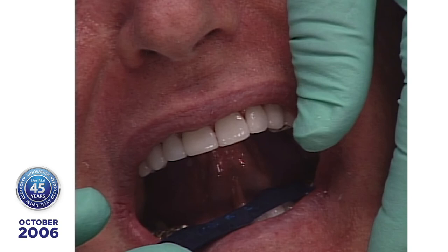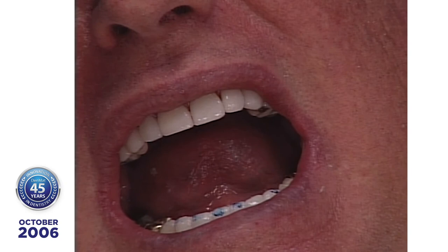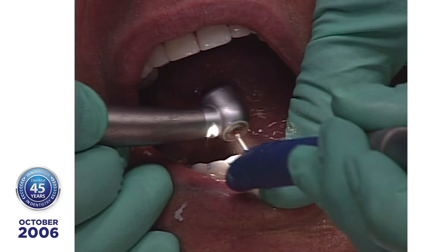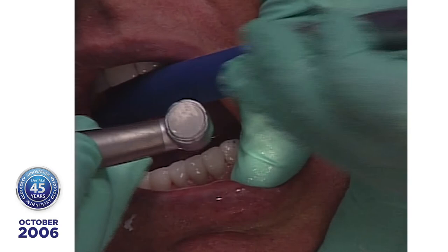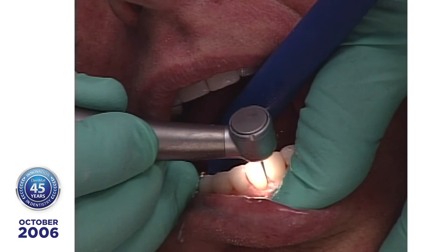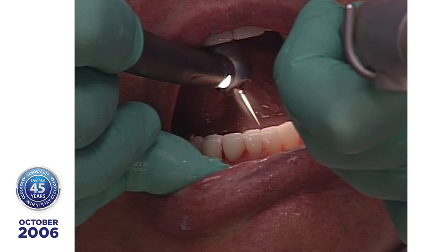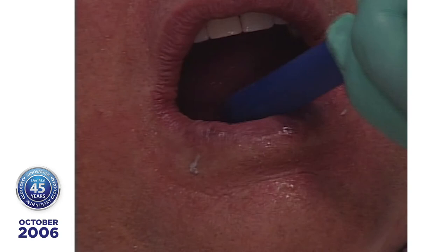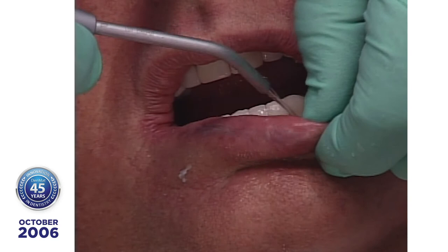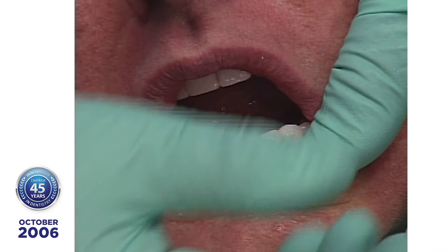See all those spots in there? What we want to do is take a long, ultra-fine diamond and gently contour these teeth so they don't hit so much. And I'm going to leave the cuspids alone first. And then we'll take the embrasures, go up here a little bit. Okay, let's have some gauze here now.